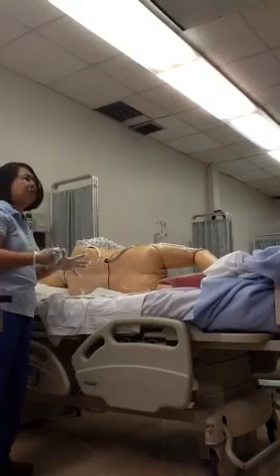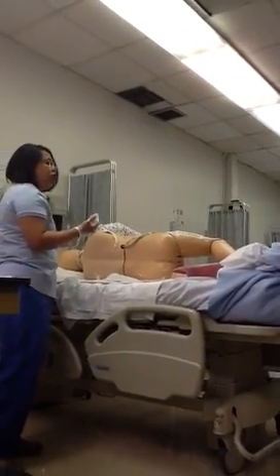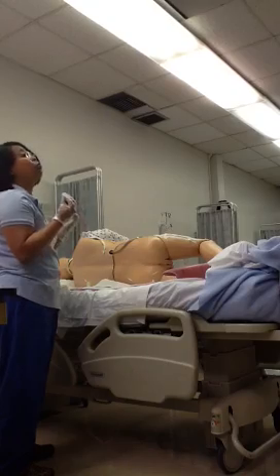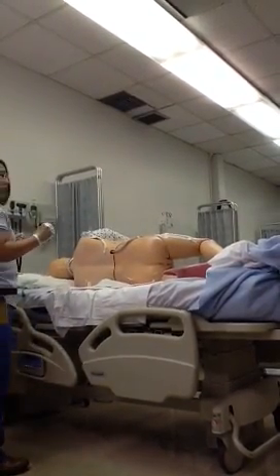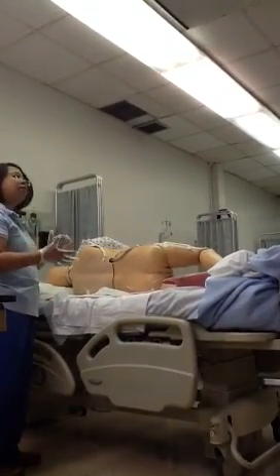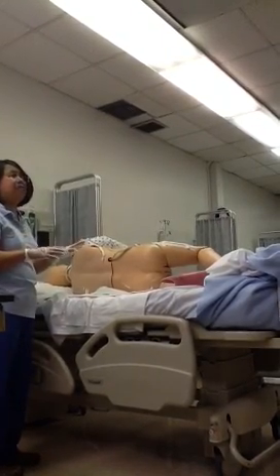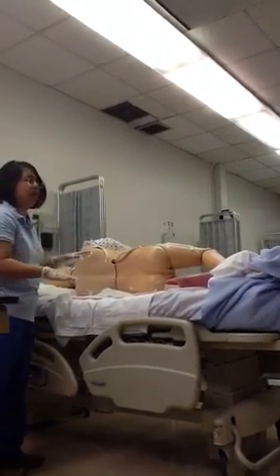Now this is something where you just don't up and leave, okay? You actually will stay here, okay? And so let it all flow in. He's still breathing. He's still trying to relax. Okay. I will tell you that in the times I have done this on real patients, some patients, depending on how full they are of feces, they may not tolerate the full 500. And you will know that if they really start cramping. Really start cramping, no matter what level that bag is.